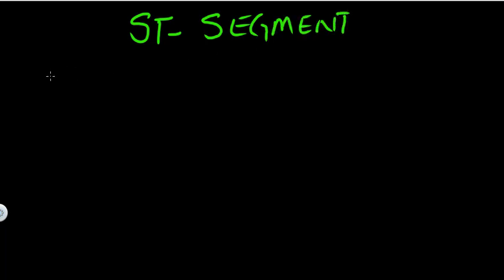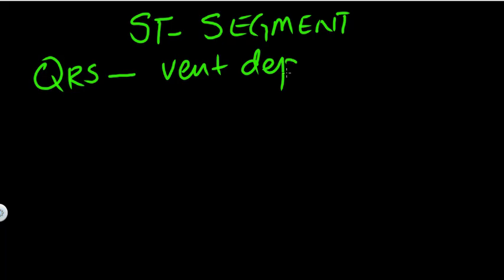Now we talked about the QRS complex, and QRS complex basically is ventricular depolarization. It's the start of ventricular depolarization or contraction of your ventricles.